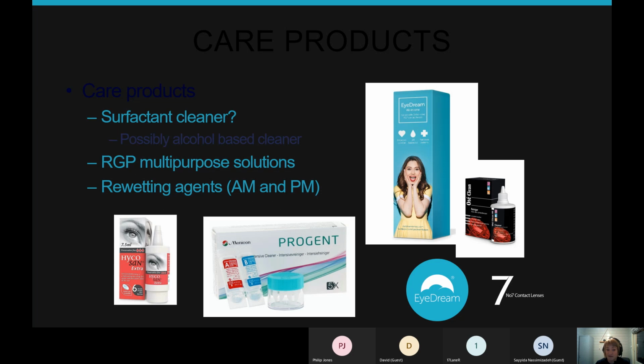So really do avoid that Boston cleaner. It also takes away all the benefits of the plasma treatment that these lenses have as standard. So avoiding that gritty cleaner is really important. If you did need to add in a separate cleaner, you can obviously add in something like the Delta or the Total Care cleaner, or the Ote Clean.